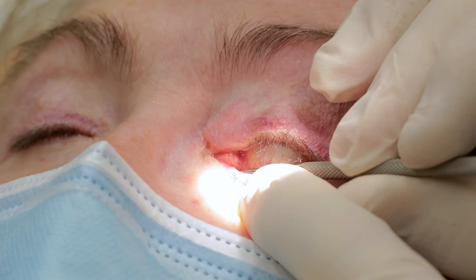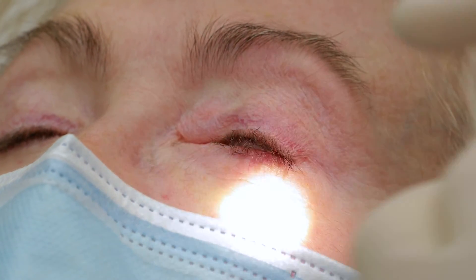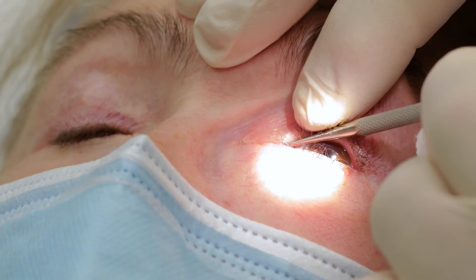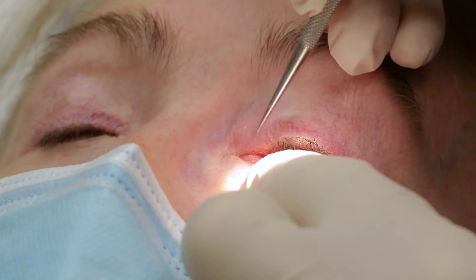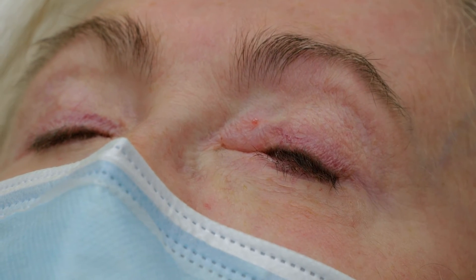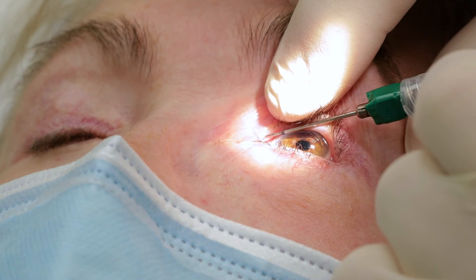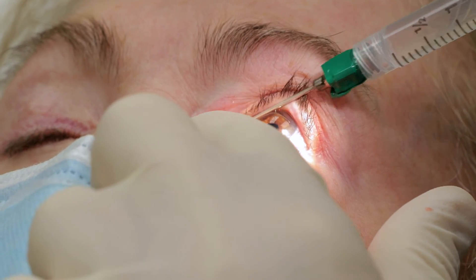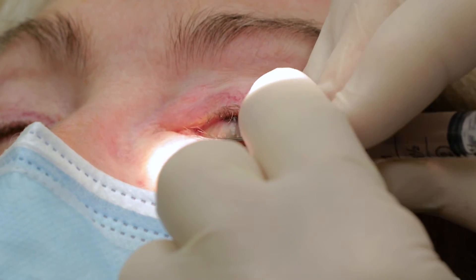Now that the local anesthetic has taken effect, I go ahead and dilate both puncta, and I will perform lacrimal probing and irrigation just to confirm the areas of stricture and to assure that I have complete anesthetic. I have seen all of these patients in advance, so I anticipate what I'm going to find. You want adequate dilation of the puncta because it takes good punctal dilation to adequately probe and stretch the canaliculi and to insert the device. You can see when I pass my irrigation cannula that I put my finger right over the lacrimal sac — that's to see if there's any distention of the lacrimal sac when I irrigate. If there's any lacrimal sac distention, that would suggest the presence of partial or complete nasal lacrimal duct obstruction.